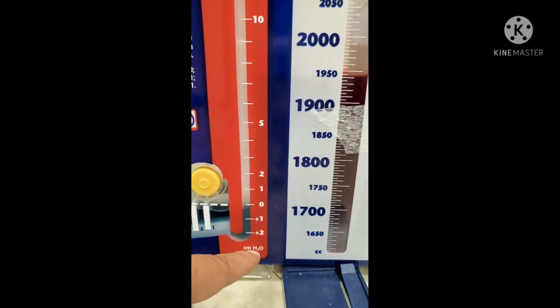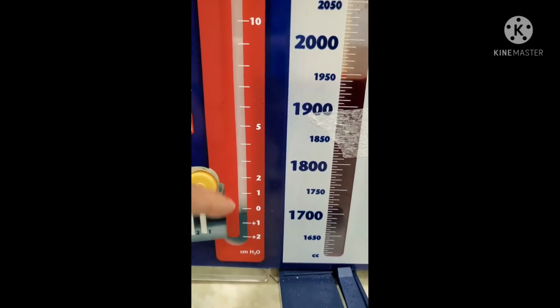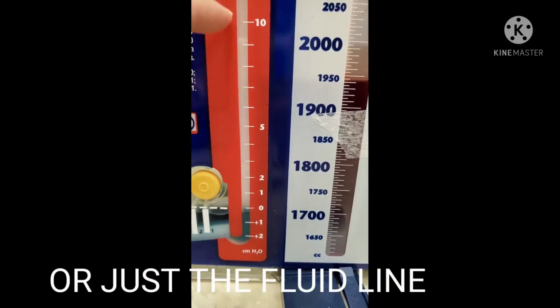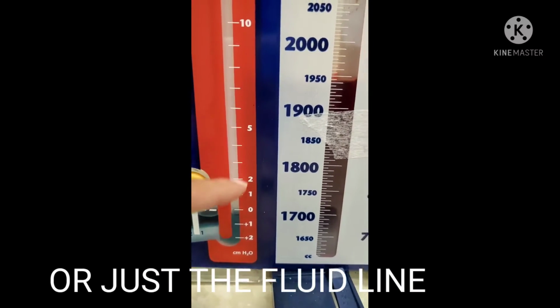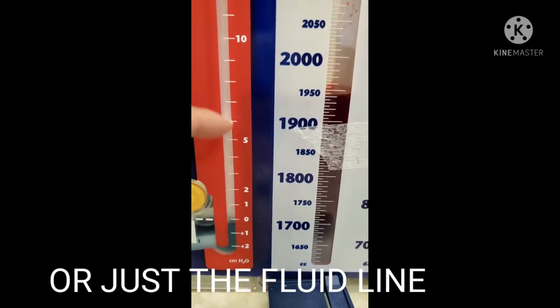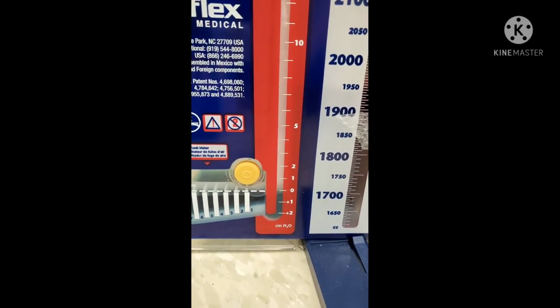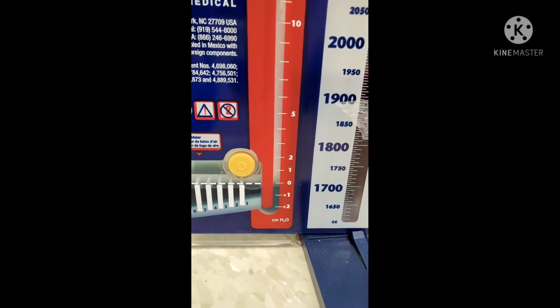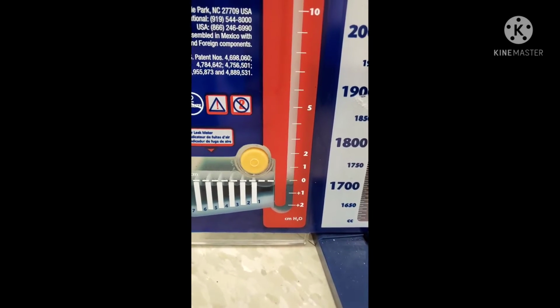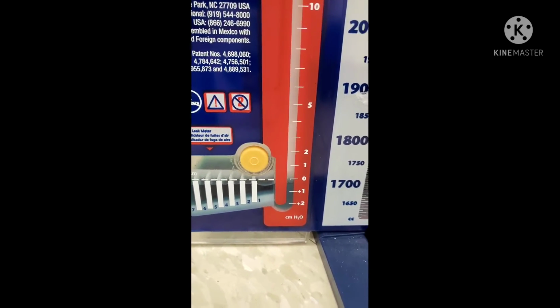Now, oftentimes there's a little ball here that you might notice go up and down as the patient breathes in and out, and that's called tidaling, and that is normal. If the ball is not going up and down, that could mean either the chest tube is blocked and it's not working, or the patient's lung has re-expanded. So obviously we're going to assess the patient to determine which one it is.